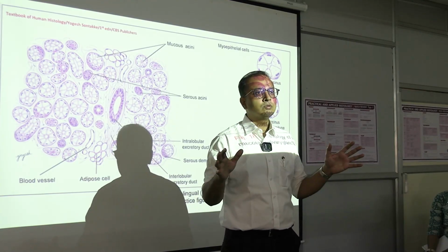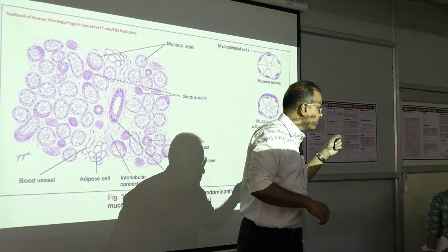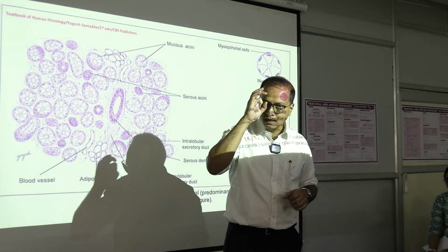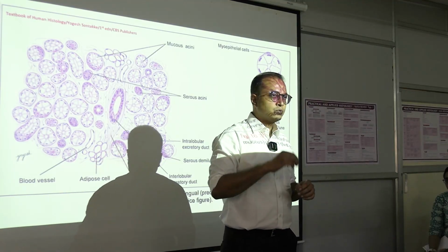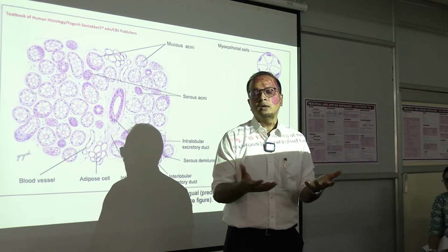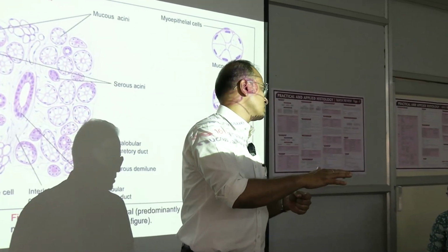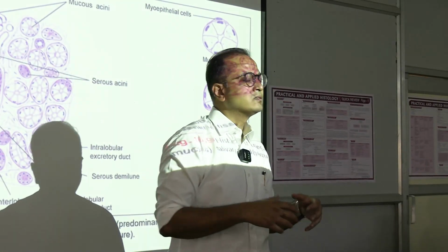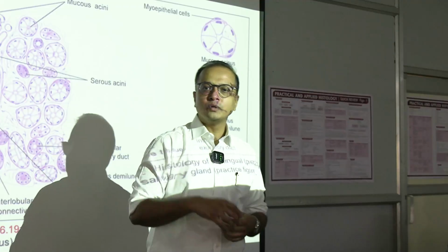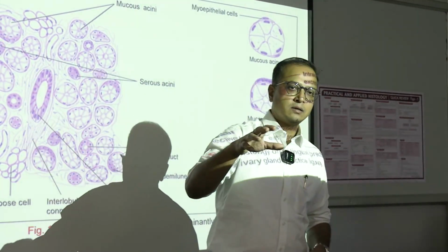You understand how to read this. If you see anything else apart from acini cells, that would be ducts. A duct can be identified by a slit present inside it. If you can see the slit, it's okay. If you cannot see it, it's fine. Sometimes it is not an error on your part, because they may be under-processed and not visible. You need to dig deep into it. If you are seeing ducts within this particular lobe, they may be of two types, striated or intercalated.